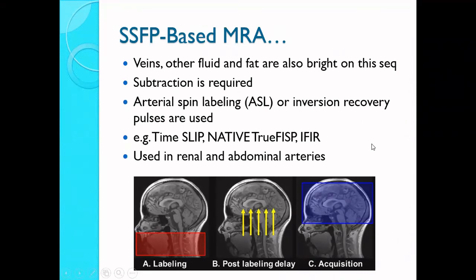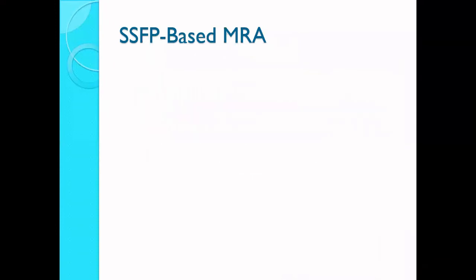We will study this in much more detail later in cardiac angiography, what this arterial spin labeling is. But anyhow, these are the techniques that have been applied, that we pre-saturate those particular protons or the spins that we want to take the image out of.